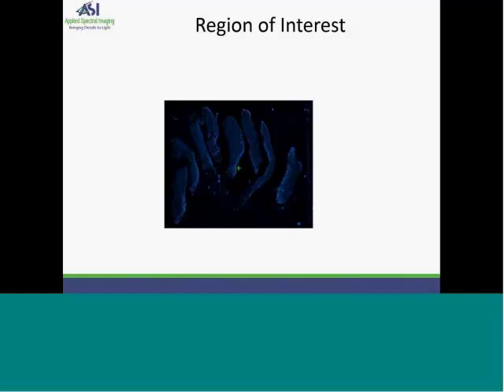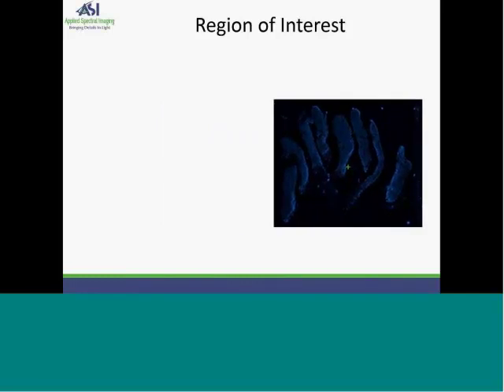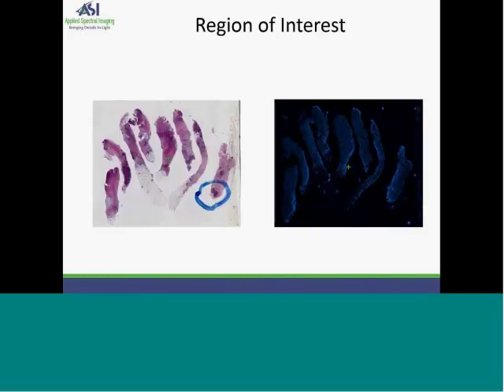And this is exactly what we do with tissue match. Since by looking at the FISH slide, we can't know with certainty the region of interest, we take the tissue sample and make two stains, one H&E and the second being FISH. And since the tissue samples are nearly identical, coming from the same sample area, we can then confidently know the region of interest on the FISH slide by viewing this clearly defined area on the H&E slide.